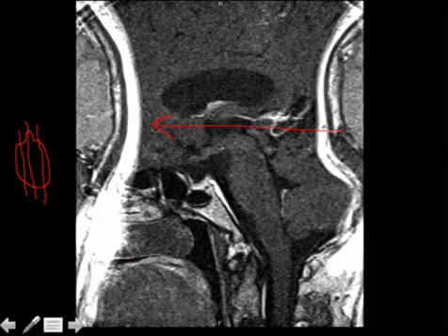So you can correct this by, one, increasing your field of view so that you're not undersampling, or you can change the phase encoding direction.